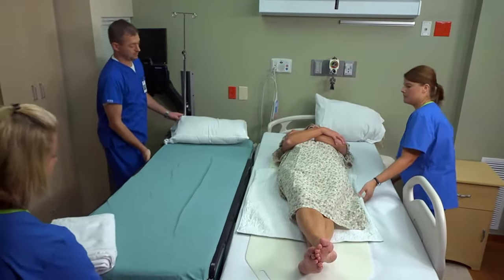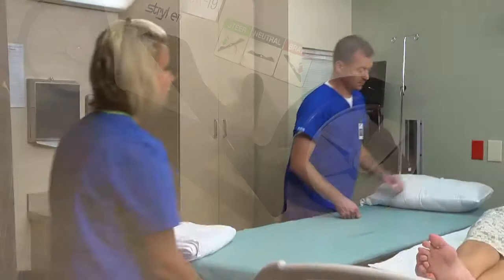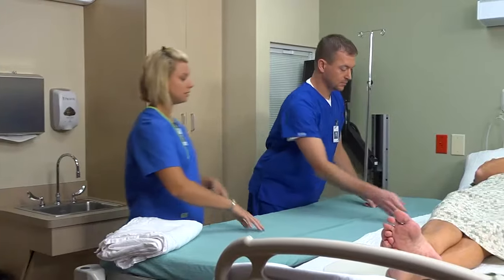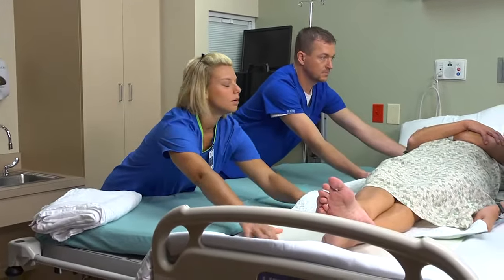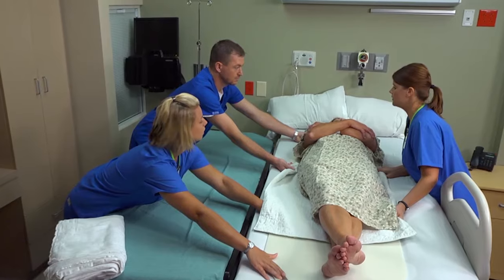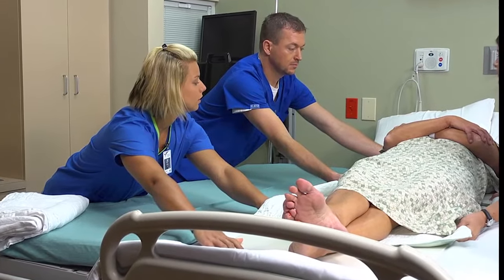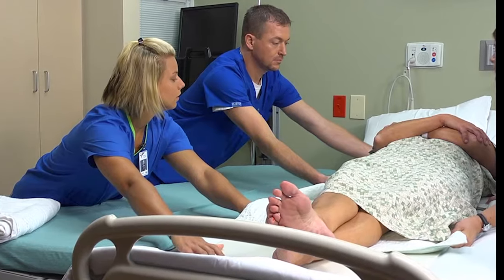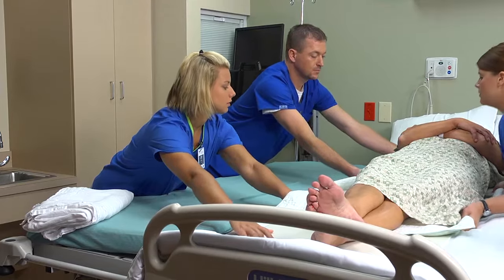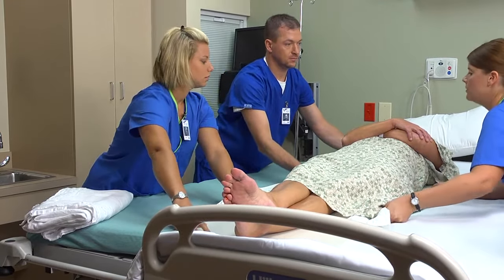Line up the stretcher with the bed and lock the brakes on the stretcher. Stand on the side of the bed without the stretcher and make sure the other two assistants are positioned on the opposite side of the stretcher. If needed, position an additional assistant at the head of the bed to support the patient's head and neck. On the count of three, pull the slide board with the patient onto the stretcher — one, two, three.